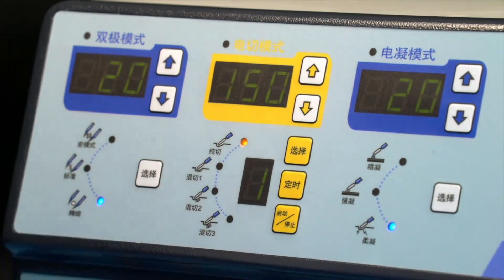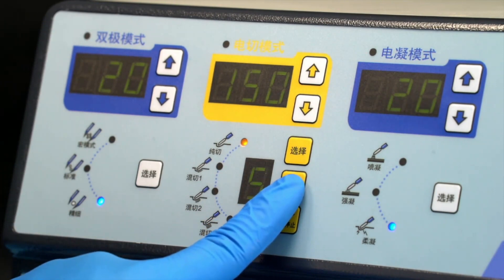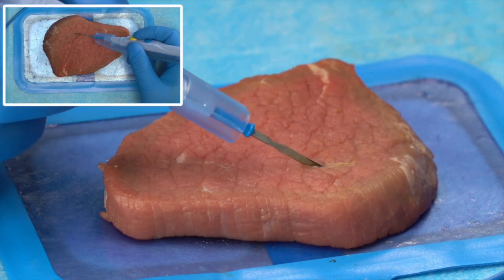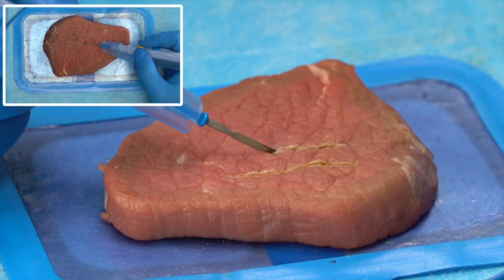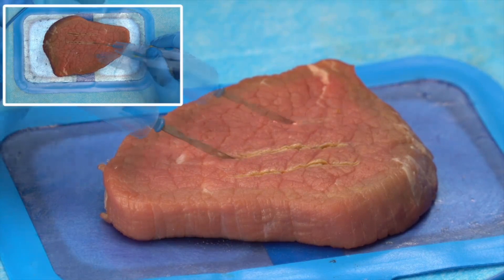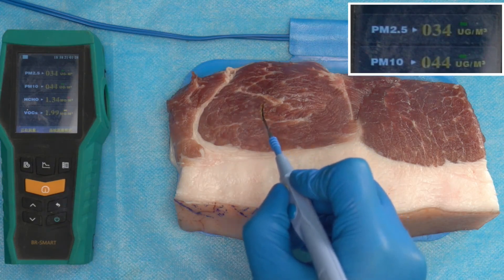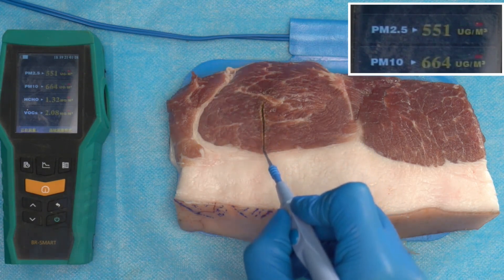The EndoCut endoscopic cutting function is an electric cutting method that cuts and coagulates when performing pedicle polyp resection under digestive endoscopy. This method can ensure that the polyp is cut without bleeding. Under different frequencies, we can also carry out different cutting settings for different polyp tissues so as to ensure the most efficient and safe operation.